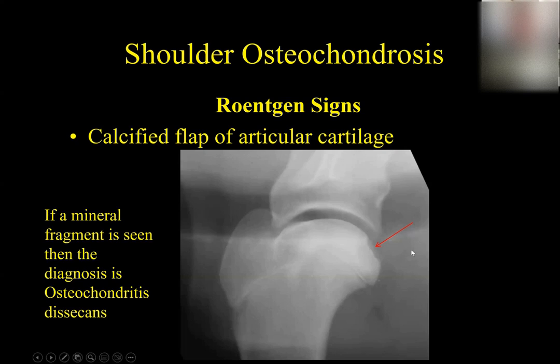The other thing you can do, if you catch it early on, is a surgeon can go in with an arthroscope, which means they make a little stab incision and put a little device in the joint itself and look around. Then they can make another stab incision at another angle. Once they find the joint mice and the little cartilaginous area of soft bone, they can clean the joint out. They can basically remove any joint mice that are in there, any mineralized fragments. They kind of vacuum them out and get rid of them.